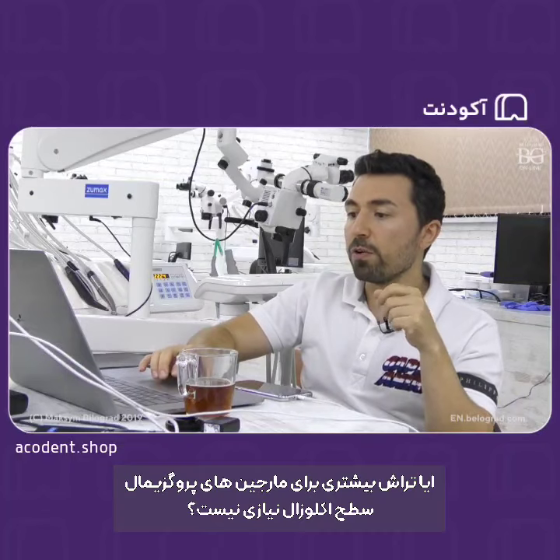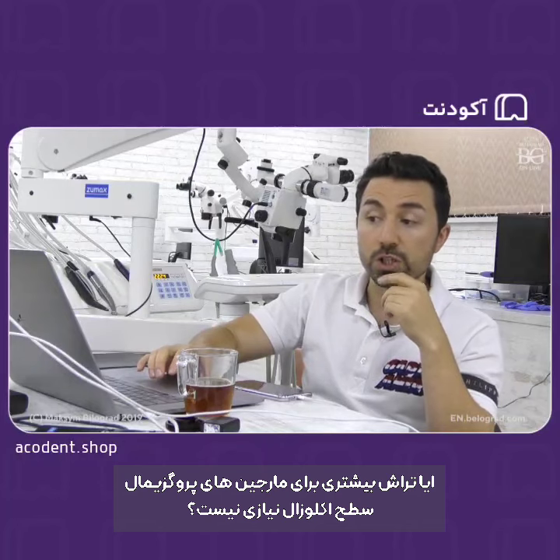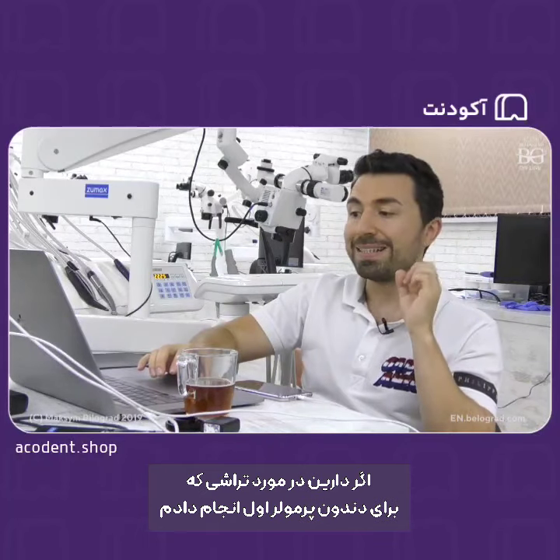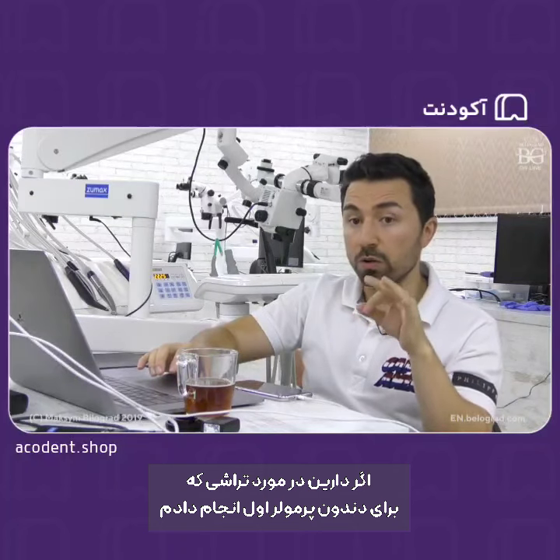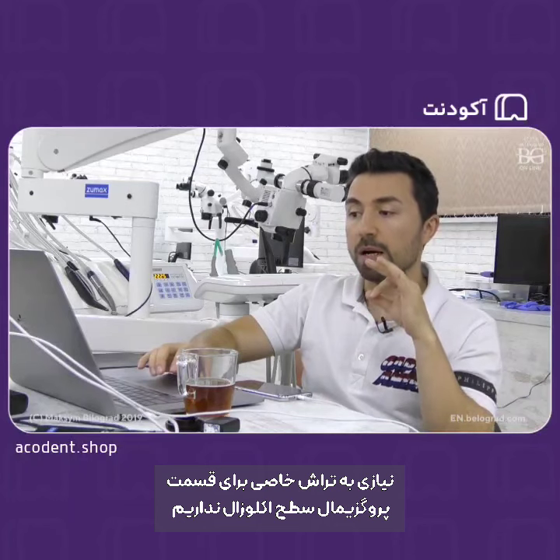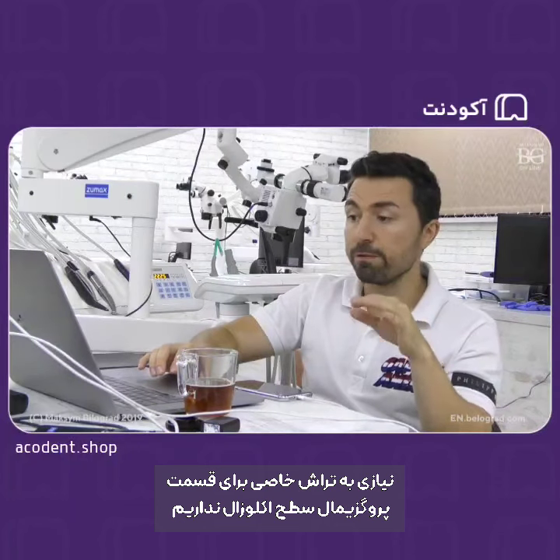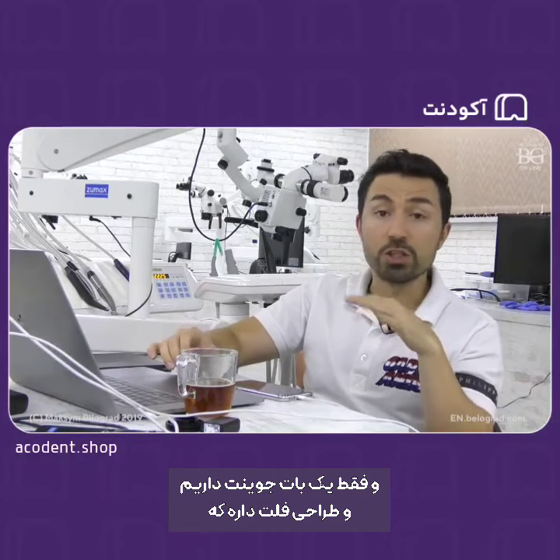There is no further special preparation on the occlusal proximal margins. If you're asking about the type of preparation that I did for the first premolar, yes, there is no particular preparation for the occlusal surface, proximal occlusal surface. It's just a butt joint.